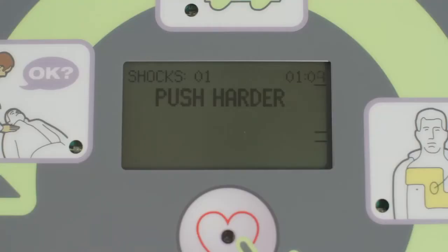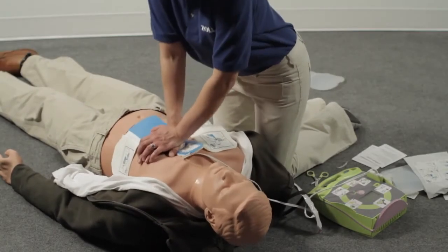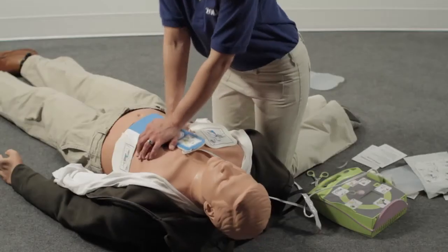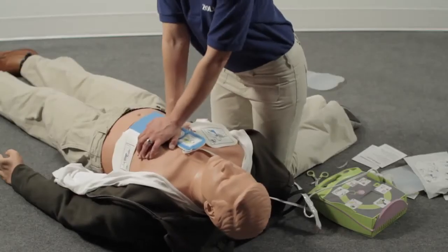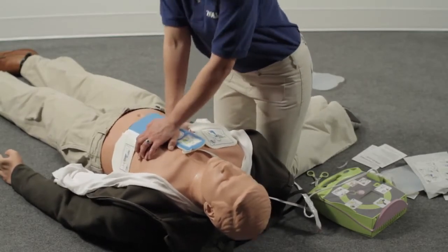After being told to push harder, if your compressions reach at least 2 inches, the AED Plus will let you know. The AED Plus also gives a real-time display of each chest compression on the bar gauge: the upper line represents 2 inches and the lower line represents 2½ inches. Each compression should be deep enough to at least touch the upper line. After giving 30 compressions, give 2 rescue breaths, and repeat this cycle until the AED Plus tells you to stop CPR.